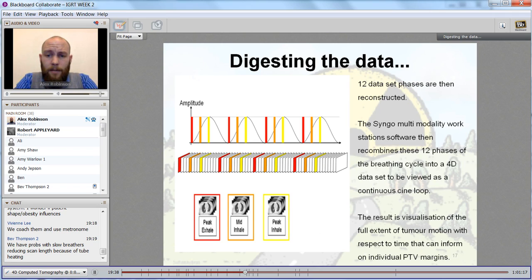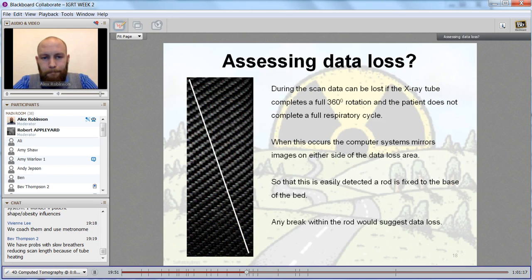That's going to be input into our planning system, which can cause them to drastically run slower, the contouring system, and the fact that we have to hold this data. So, there's, once again, rationale between having more or less.